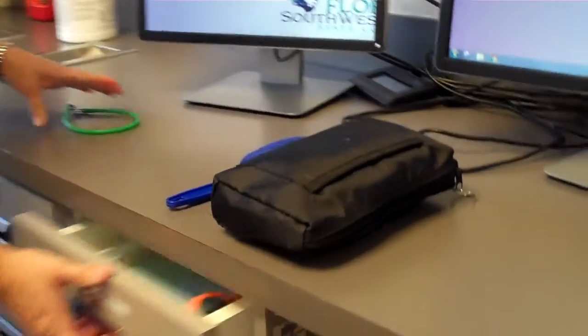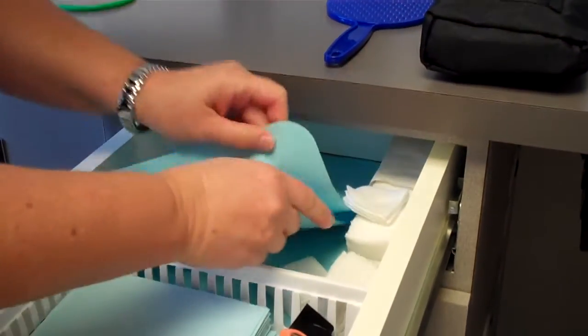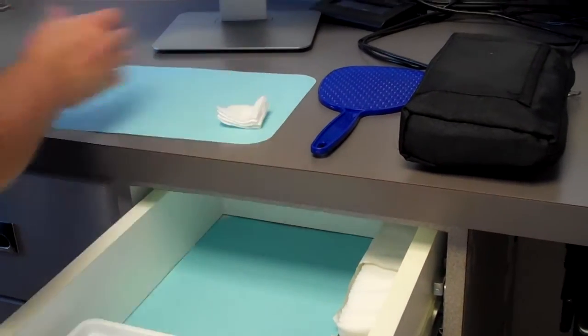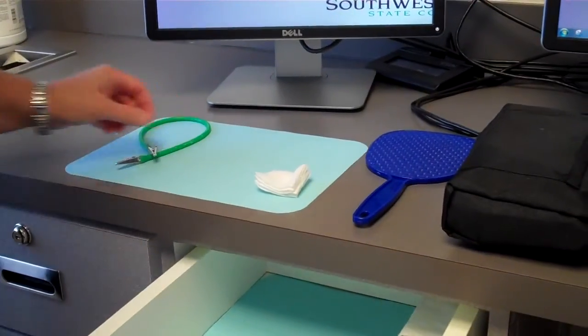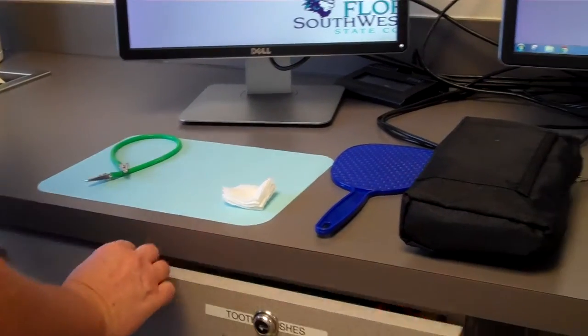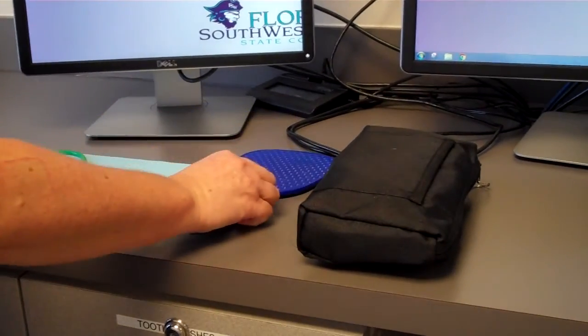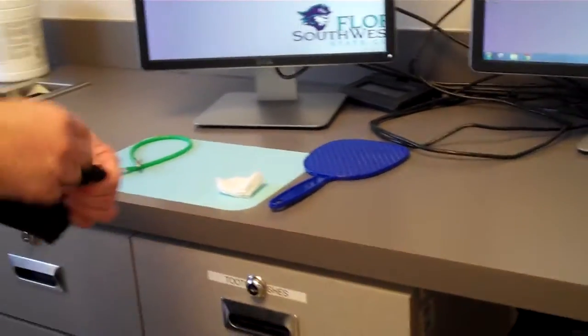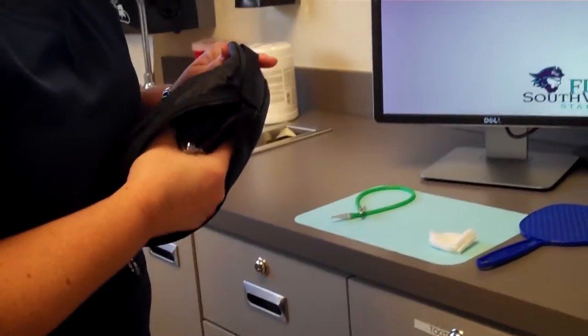In the top drawer, you will take out one tray cover and a couple pieces of gauze. You'll have your bib clip available for you to be using on the tray, and your mirror so that you'll be showing the patient what you're going to be needing to show them for patient education. And then the blood pressure cuff.